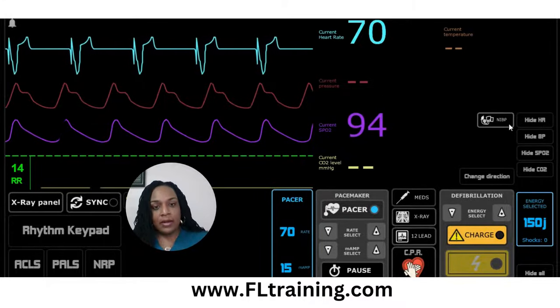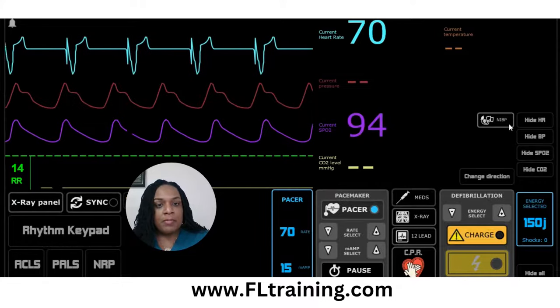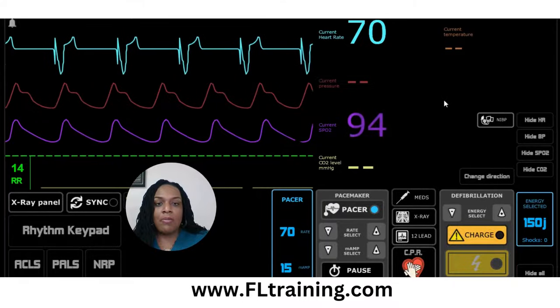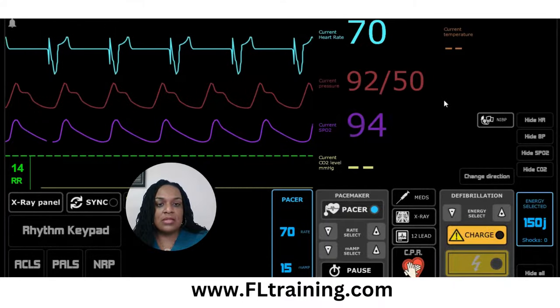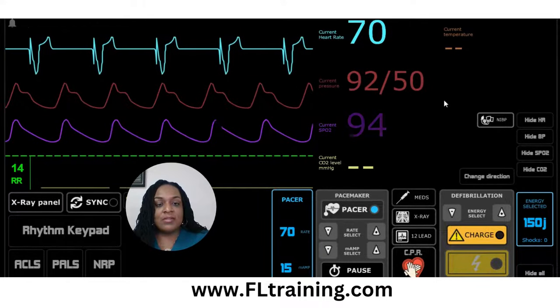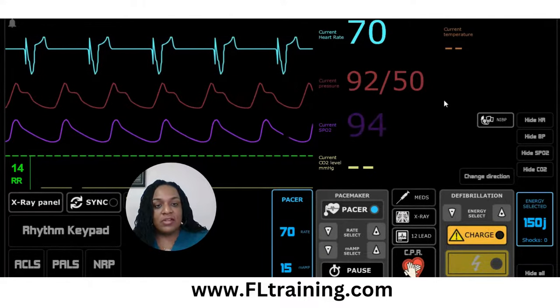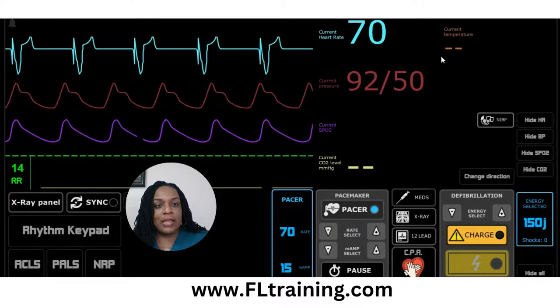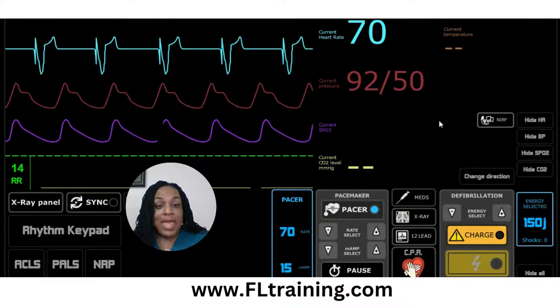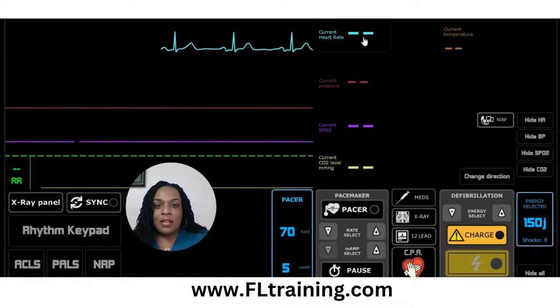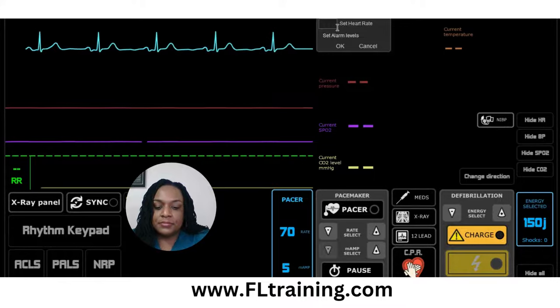Most patients do not like the transcutaneous pacemaker — it's not comfortable. But it is something we can use to keep their heart rate up and improve their cardiac output until we can either get them to surgery for an internal pacemaker implantation, or give them digibind to reverse the effects of digoxin. This is how you would treat someone with symptomatic bradycardia. Let's reset and change the heart rate to 30 to go through this one more time.